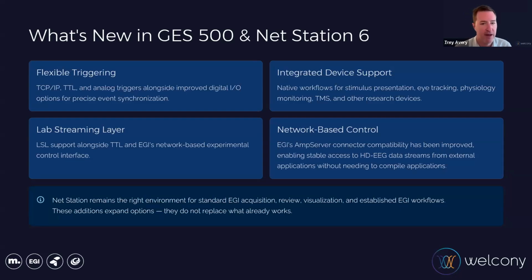So we have a variety of new ports that easily accept or send out TTL pulses to sync things. We have a variety of options to sync different devices. Today, we'll be going over the improvements in lab streaming layer and then also the traditional network-based connectivity.